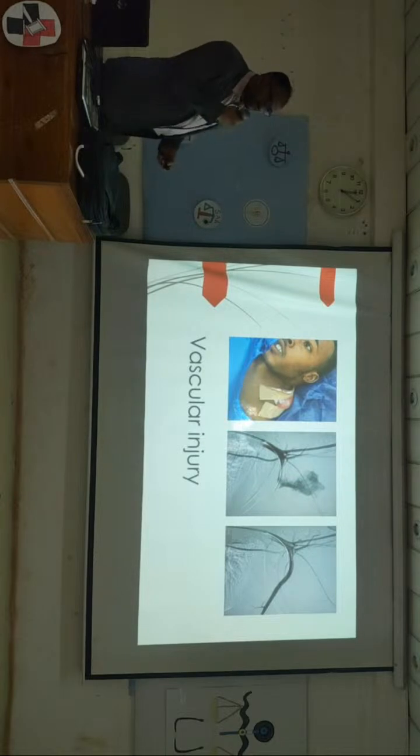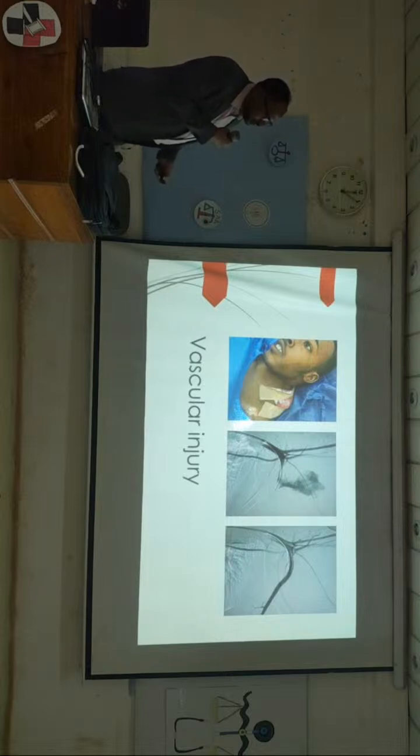But with a minimally invasive procedure, we did an angiogram for these lesions, and we put a stent. This is the first stent, still there is leaking, and after putting the second stent, the lesion and the bleeding disappeared, and the patient did well.